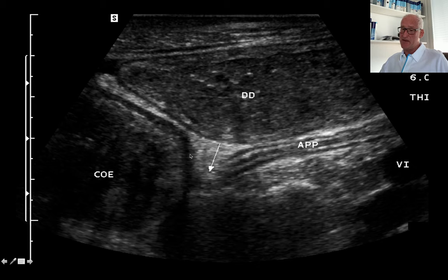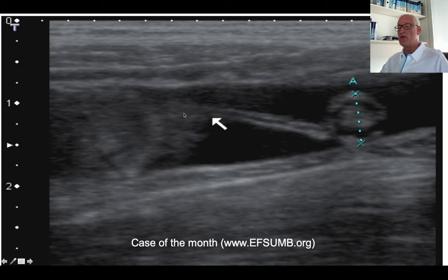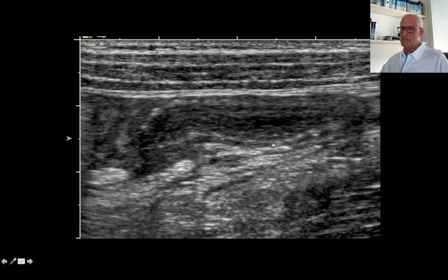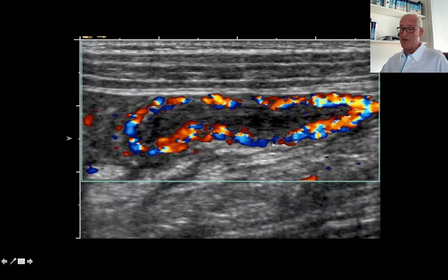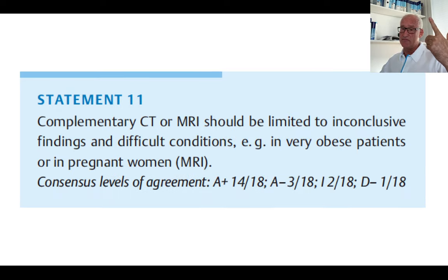How to find the appendix? At the bottom of the cecum, where the taeniae join together, there is the appendix — you always have to differentiate it from the terminal ileum. Ultrasound, the best, allows you not only to see the appendix, but also to show the mesoappendix and the normal appendix when there is a little free fluid around. Ultrasound shows appendicitis at an early stage and should be used as the first imaging method in children and adults. CT and MRI should be limited to inconclusive findings and difficult conditions.